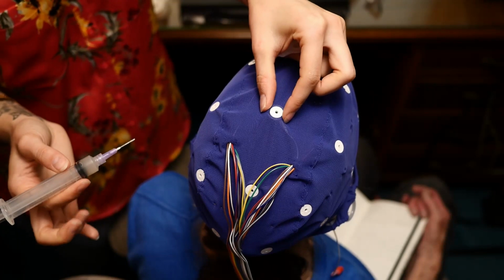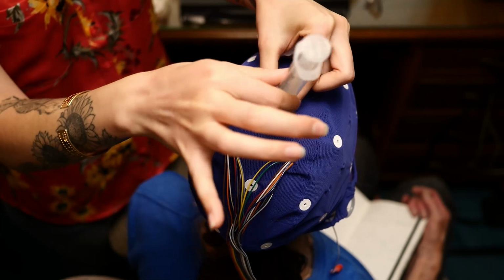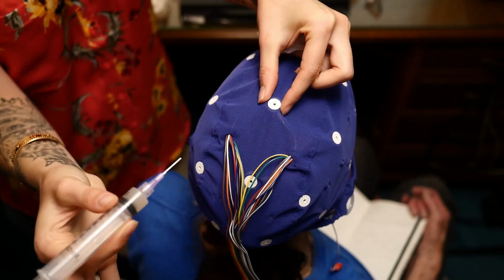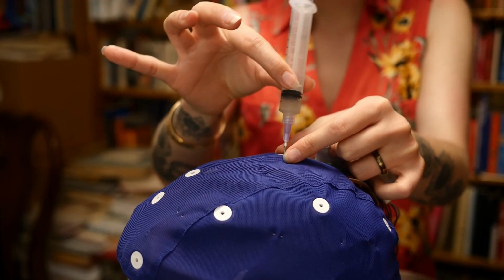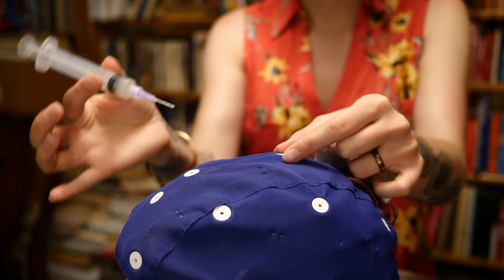So we grab our electrode again, and with our syringe or dowel, we are going to draw a large diameter circle inside of our electrode. The larger the diameter, the less uncomfortable it is on the client, and the more ground you cover. The point of this is to break up any oils or residue that are on the scalp, thus allowing the gel to settle better and make a better connection.